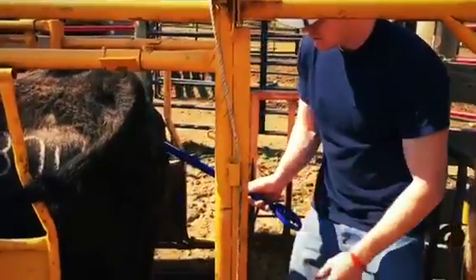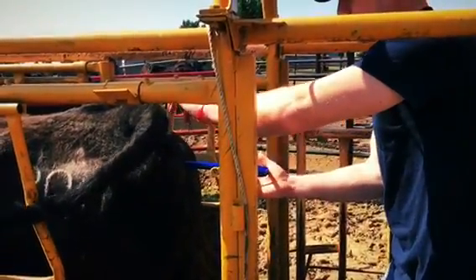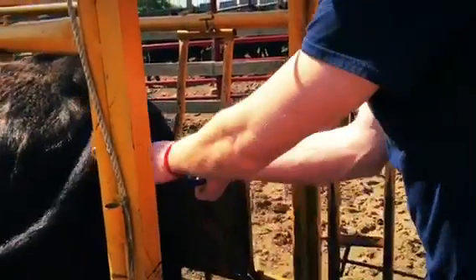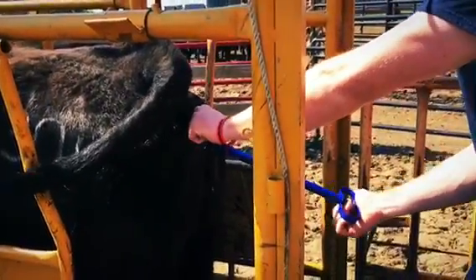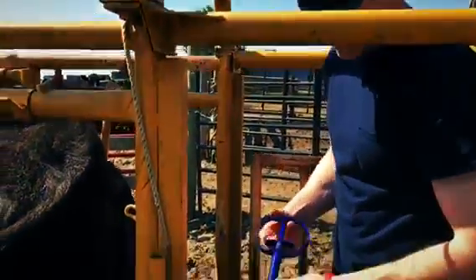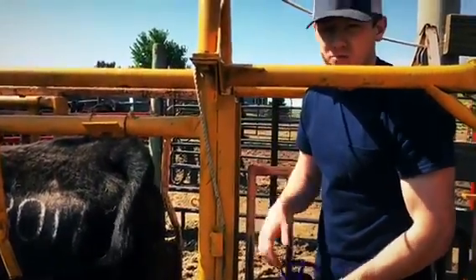You start at a 45-degree angle so that you don't hit the bladder. You go up, in, in as far as you can go. There's a trigger right here on the Easy Breeder — you trigger it and give it a couple of little pulls like that. You'll see that the CIDR is still in and the gun is out. You'll see the tail here, and when it's time to take it out, you pull on the tail and it'll just pop right out.